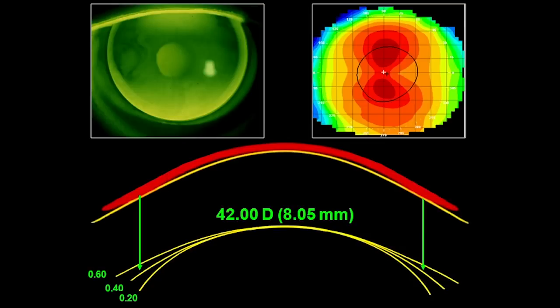Now, what makes this a little bit tricky is that the contact points in the periphery, depending on the eccentricity of the eye, can vary rather dramatically. So most of us have been taught to fit rigid lenses using central keratometric readings. And this just shows you maybe one of the built-in flaws of using a keratometer to fit rigid lenses. Not that it can't be done, but why it may be a little challenging on some patients more than others.